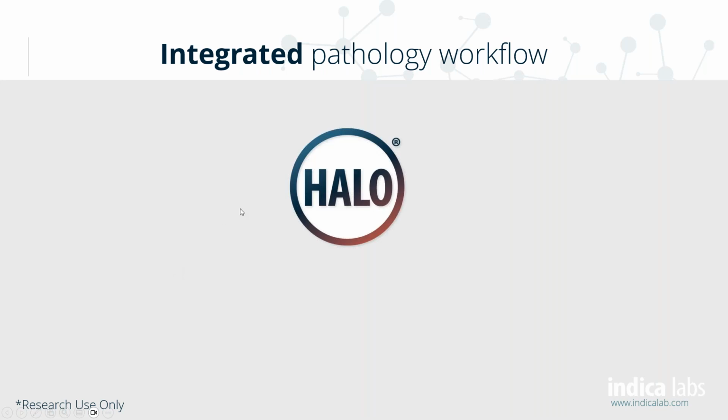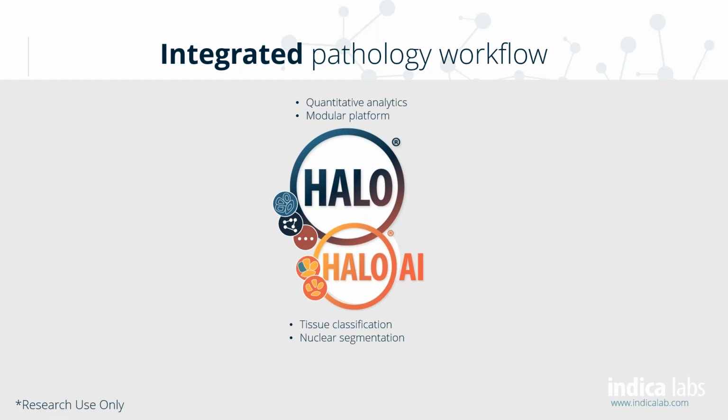As you know, HALO is our image analysis powerhouse, and it is scalable. So it means that various analysis modules can be chosen depending on the applications of your groups, such as cell segmentation algorithm, tissue classification, serial section alignment, and so on. Additionally, we have HALO AI, which is our artificial intelligence add-on that allows users to train the software to recognize any structure the human eye can recognize, such as glomeruli in the kidney, segmenting the tumor tissue from the stroma, and even doing it at the cell level.